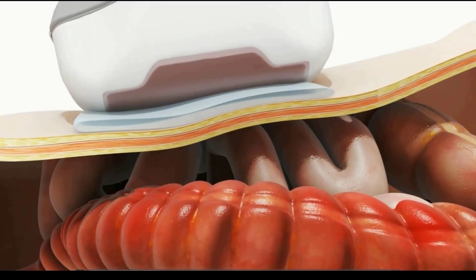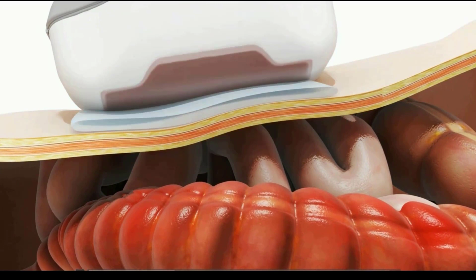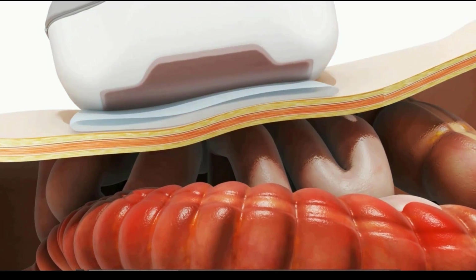But the way the technology works in this case, if I pause this at the right moment, I missed the light pulse there. But the handheld detector in this particular case, or it could be an animal scanner, which operates very similar to PET or MRI, where we translate an animal through the imaging plane. But what would happen in either case is a pulse of light comes from the detector, and this shines into the tissue. The light then gets scattered and illuminates a particular region of interest.